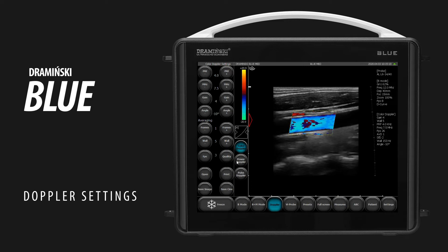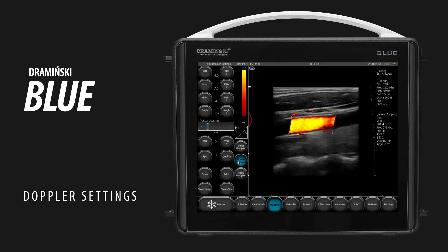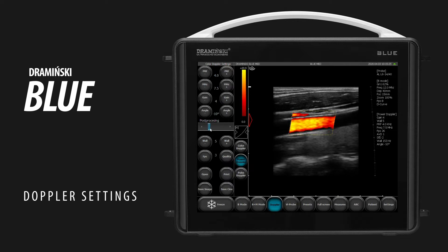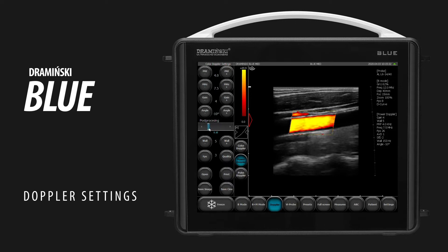Tap the Power Doppler button to turn it on. Use the Post Processing slider to adjust the frame averaging and resolution of the color. Other adjustments are the same as for the color Doppler.